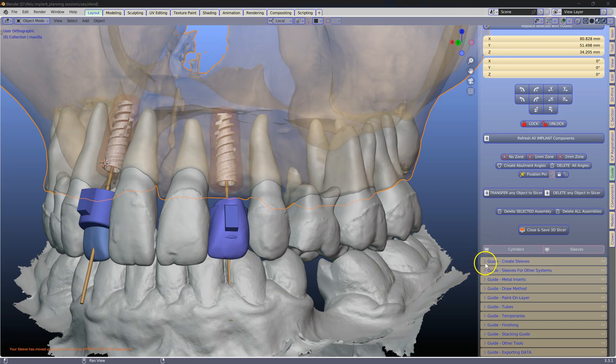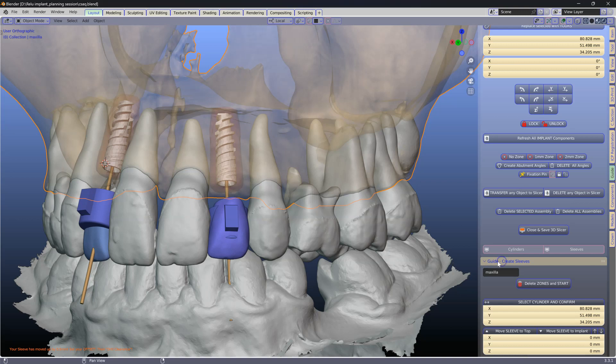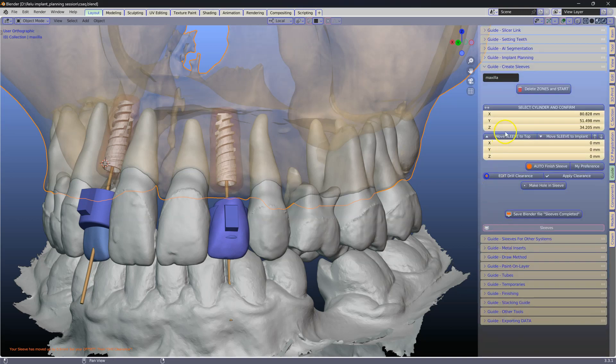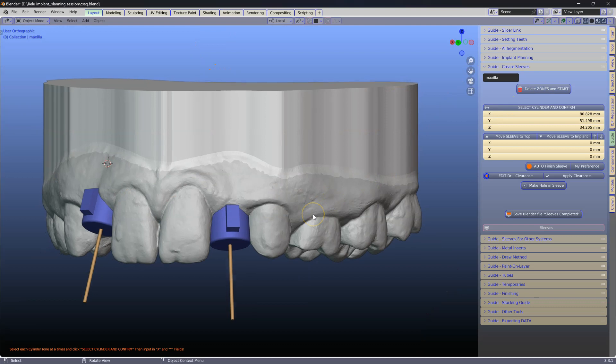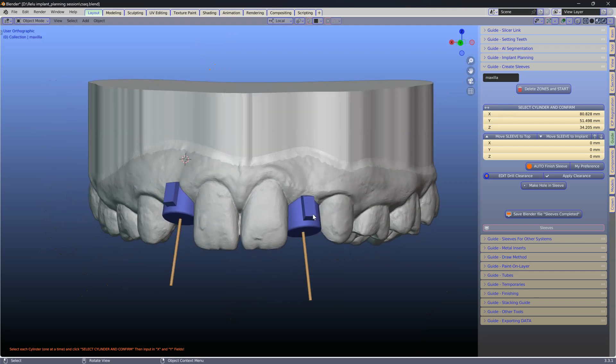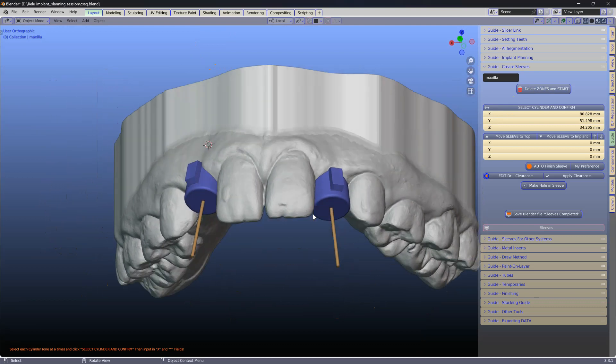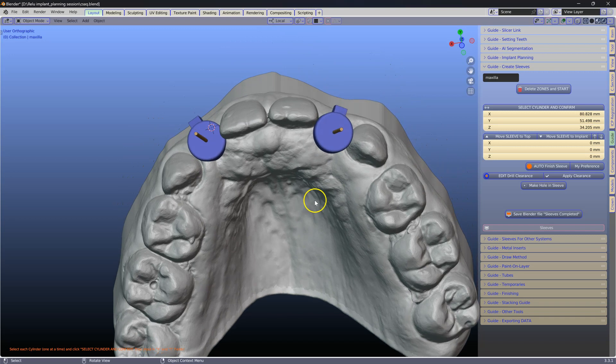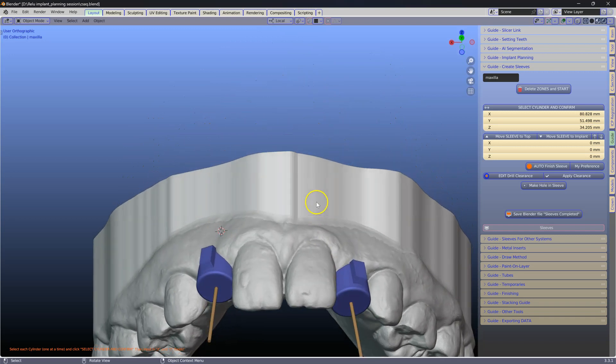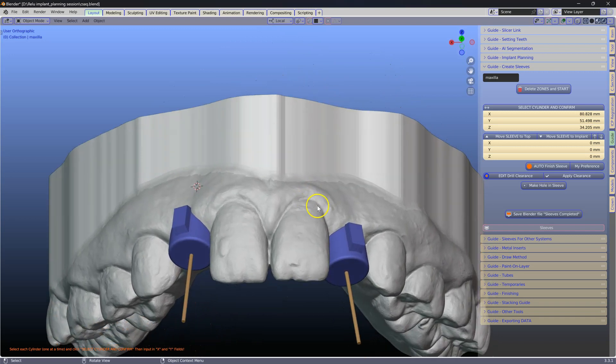Go to the guide, sleeves, and the first thing we are going to do is delete the safety zones and start the procedure. You will notice everything else has been hidden away because we are focusing above the surface.